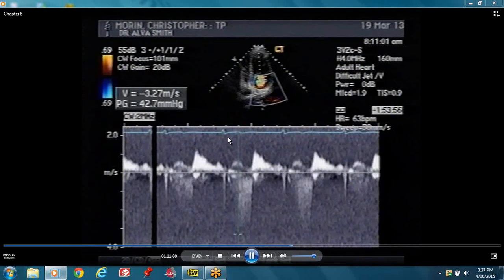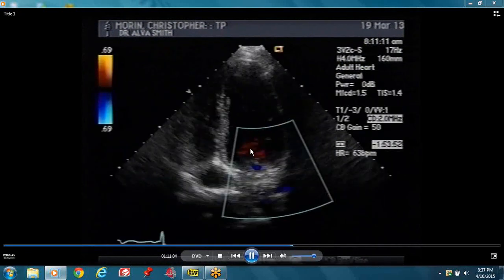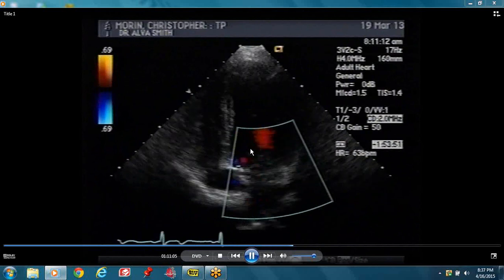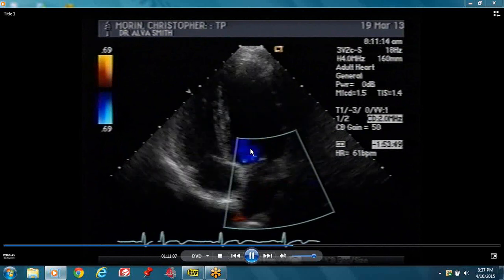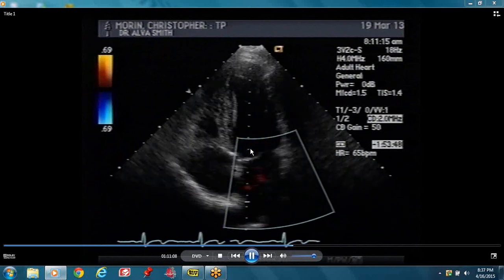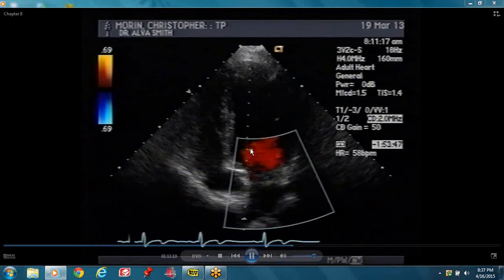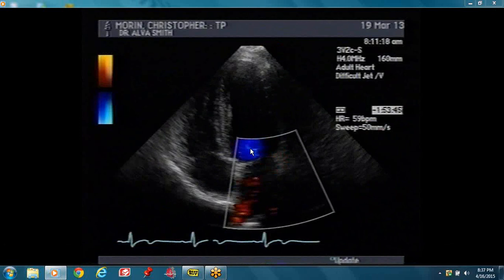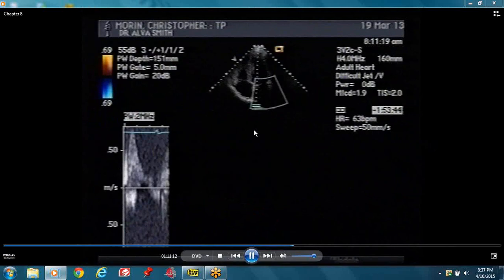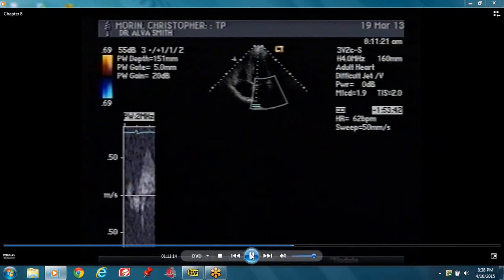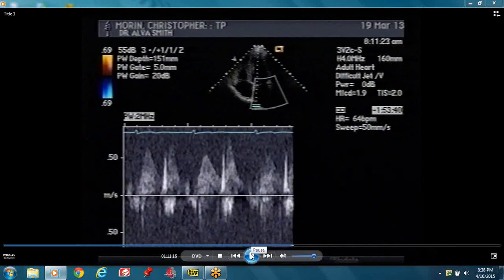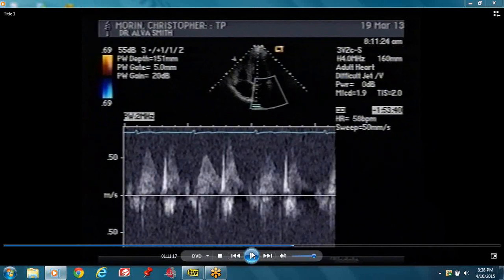Remember, mitral regurg is a systolic flow from the QRS to the T wave. In systole, the heart muscle thickens. Now we're doing the pulmonary vein flow.